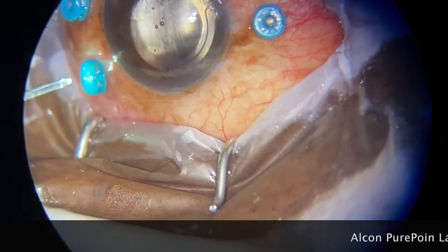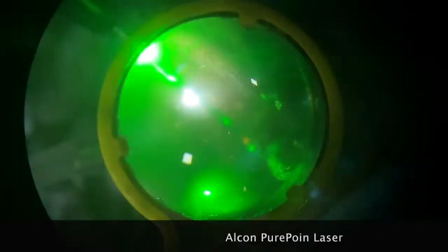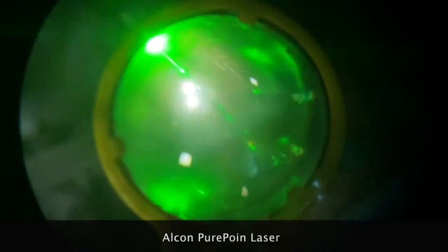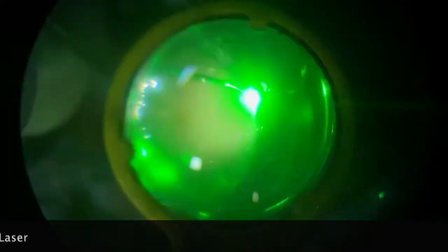In straightforward cases like this, I prefer to put gas, either SF6 or C3F8, instead of silicone oil. Another advantage of the trocar system — I can exchange the chandelier with my endoilluminator for superior illumination. After putting laser around the main breaks, I normally do 360-degree laser barrage, just in case there's a tiny break that I missed, so it should be covered. My retinotomy will be the last to put laser around after the last drainage usually. In this case I've decided to put C3F8. I debated with my sister for some time, but we all decided to put C3F8 because we wanted the gas to stay in a little bit longer.